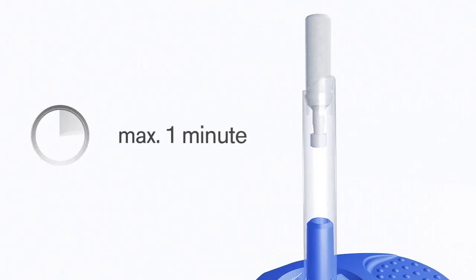After saliva has been collected for a minute, check the indicator. If the quantity indicator is blue, sampling can be stopped. Otherwise, continue to collect saliva for up to four minutes in total. After four minutes, enough sample will have been collected for testing.